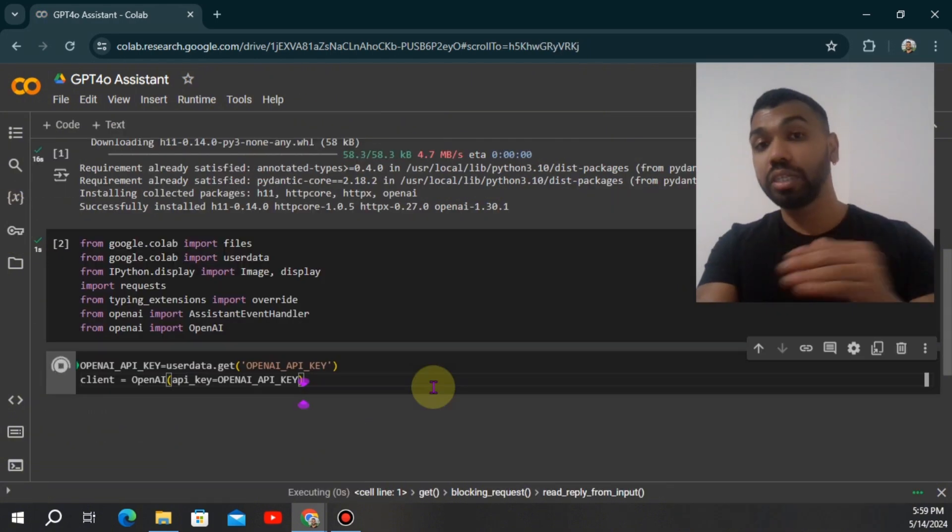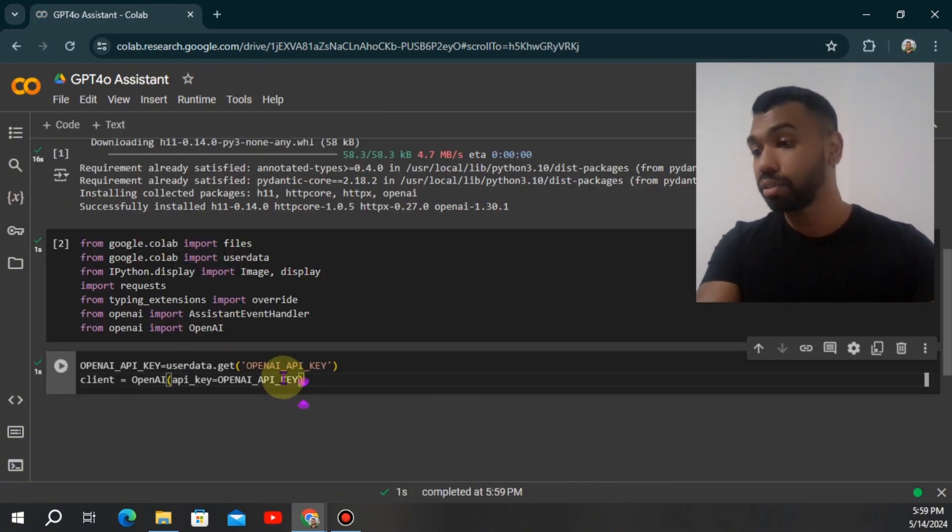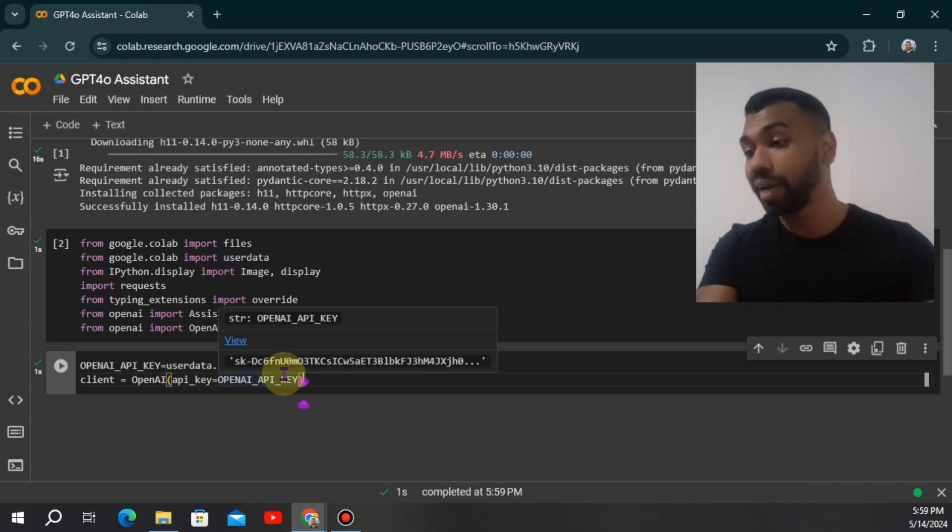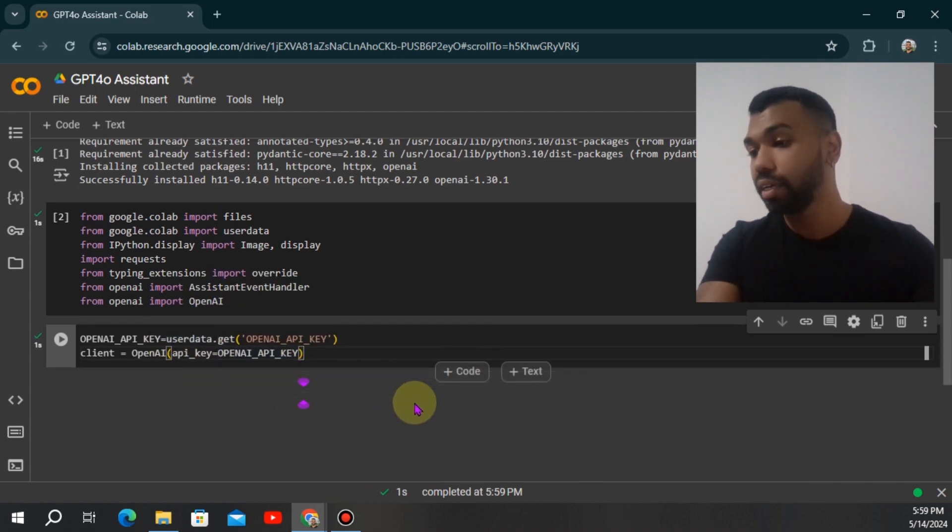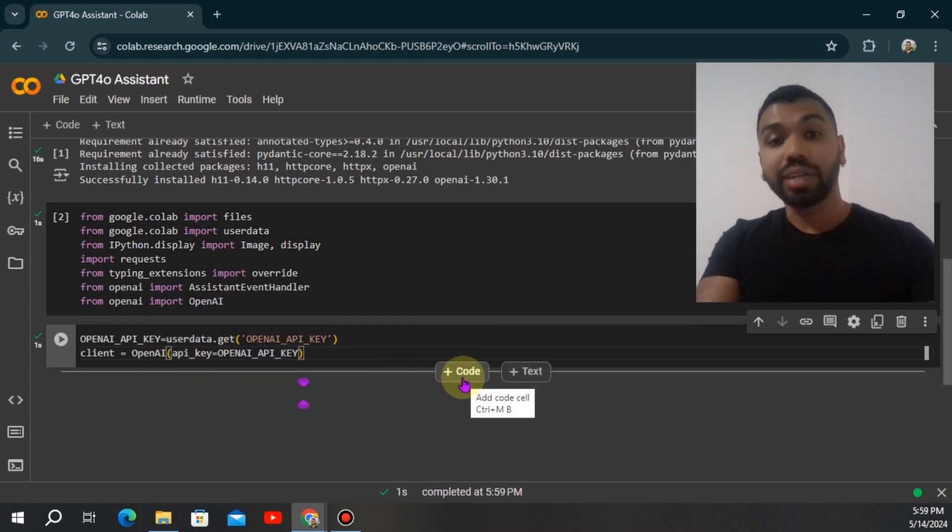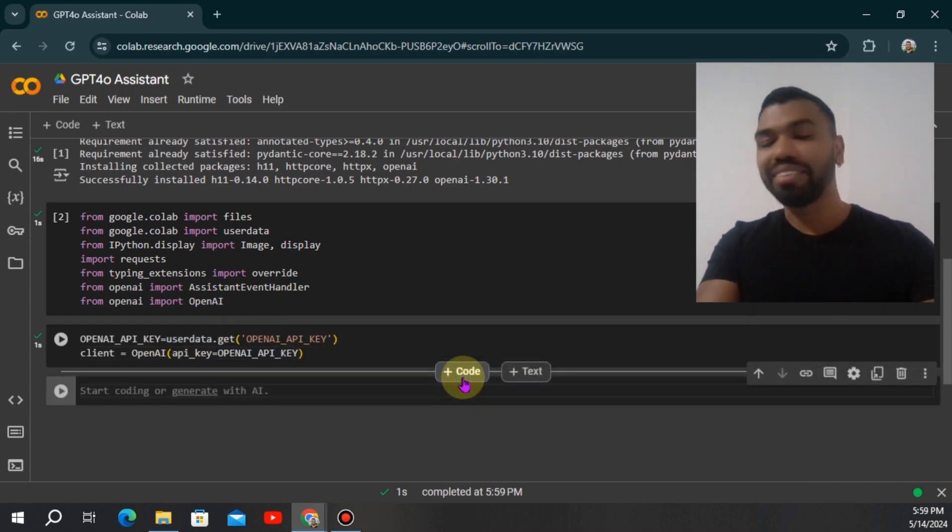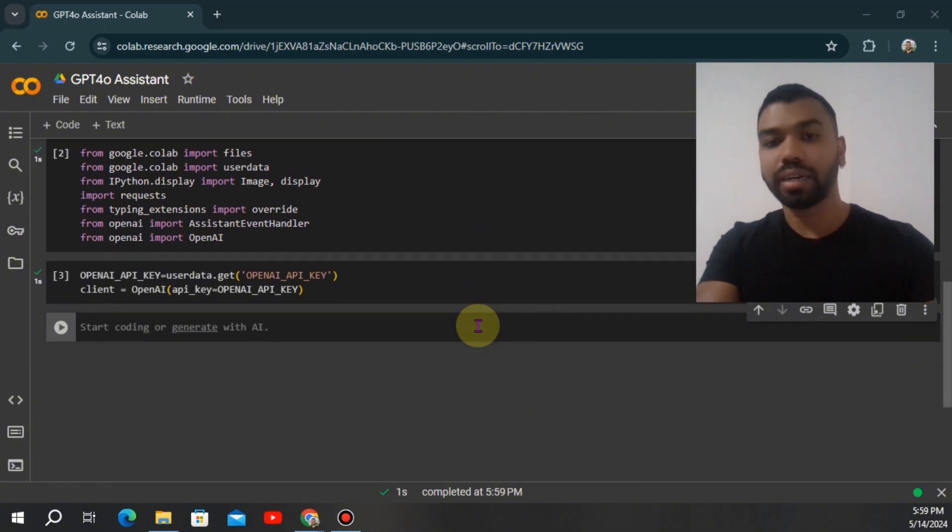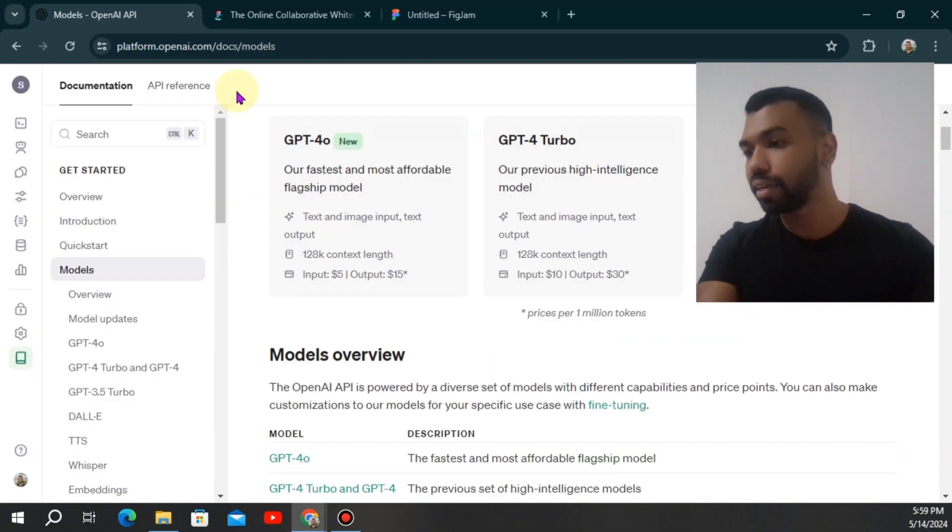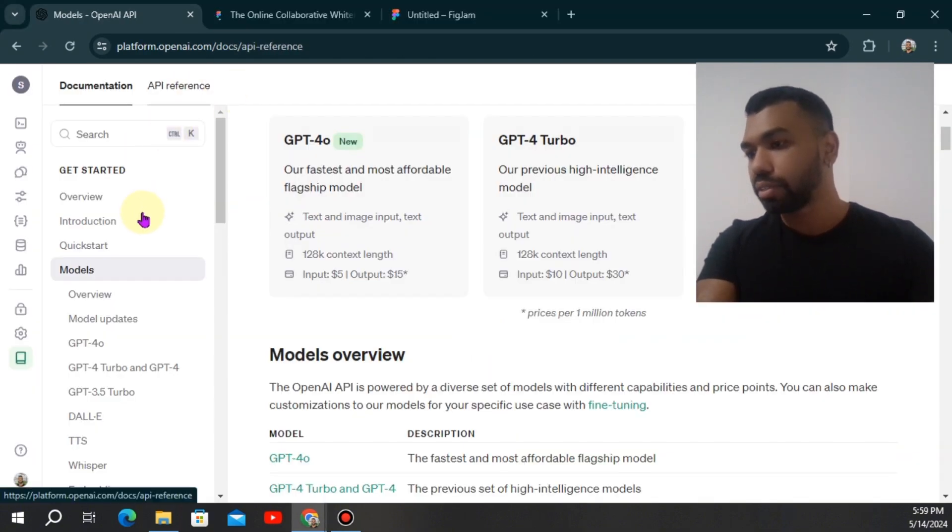Also make sure you have your OpenAI API key available and plugged in under the secret section. We're now going to use the OpenAI function provided by OpenAI to authenticate our client object. Now with our client object, we have access to all these functions and models that OpenAI has provided us under API reference.